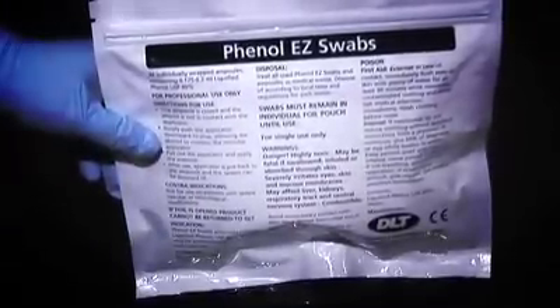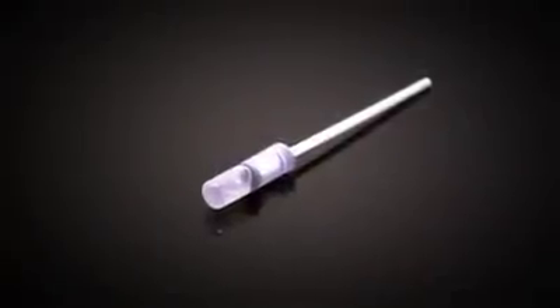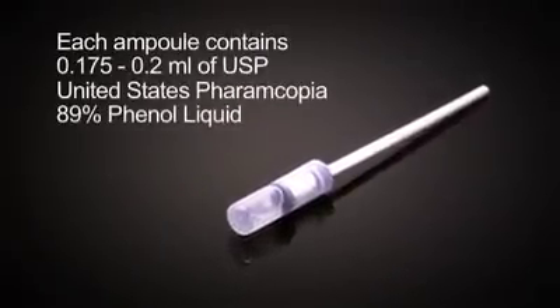Phenol Easy Swabs are the only application device for strong liquid phenol approved for nail matricectomy by the MHRA. Each ampoule contains 0.175 to 0.2 millilitres of USP (United States Pharmacopeia) 89% phenol liquid.